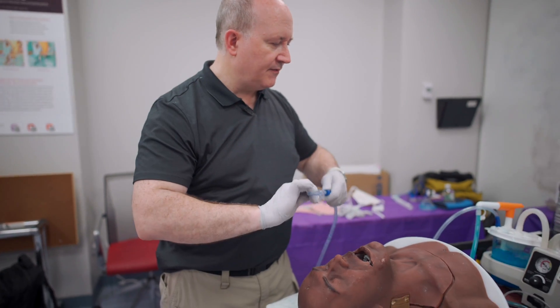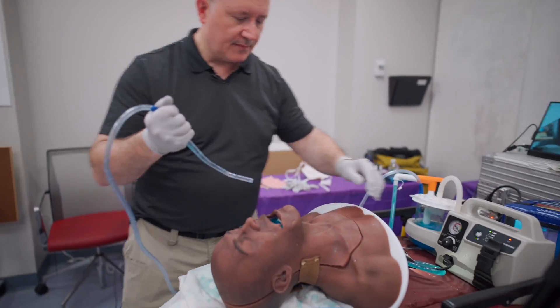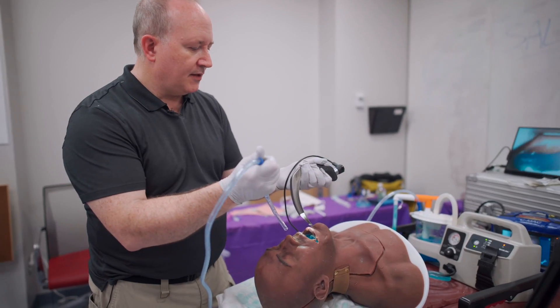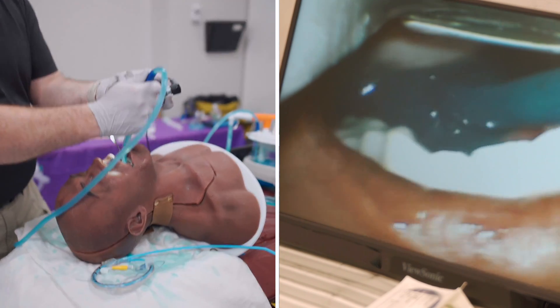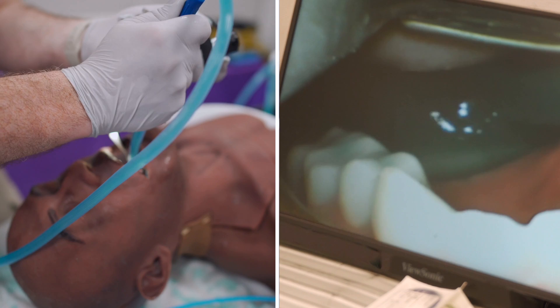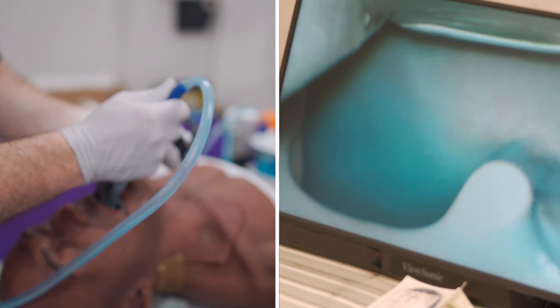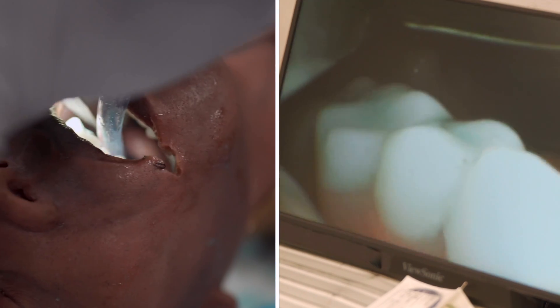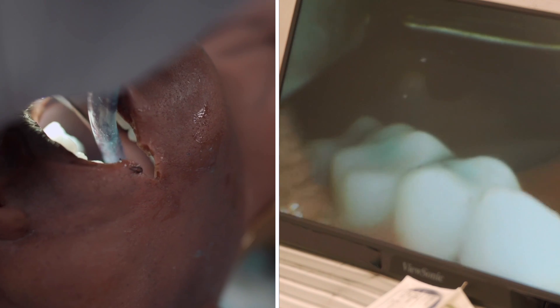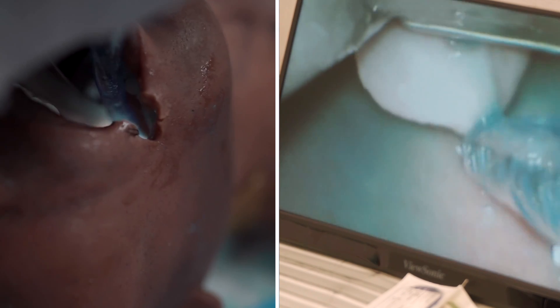Now we're going to transition to the advanced life support segment of SALAD — suction-assisted laryngoscopy. I'll begin by activating my portable suction unit. As we can see through the camera footage of my video laryngoscope, this is a completely contaminated airway. I'll begin to decontaminate the oropharynx and hypopharynx. I'm looking directly into the airway now — at the uvula, the posterior pharyngeal wall — and I'm going to begin pushing the tongue into the floor of the mouth and lifting to simplify the insertion of the video laryngoscope.